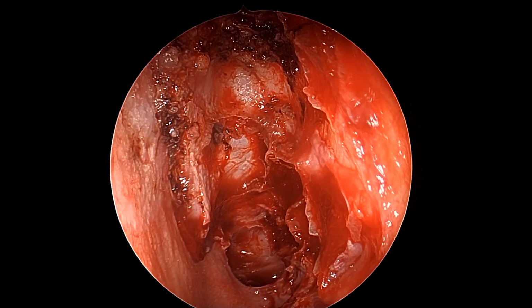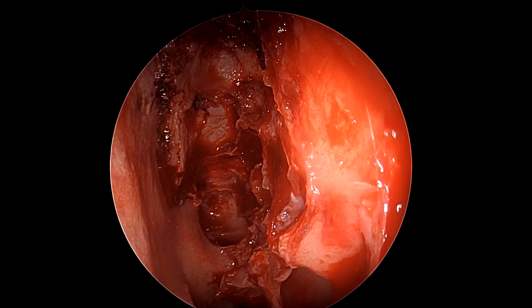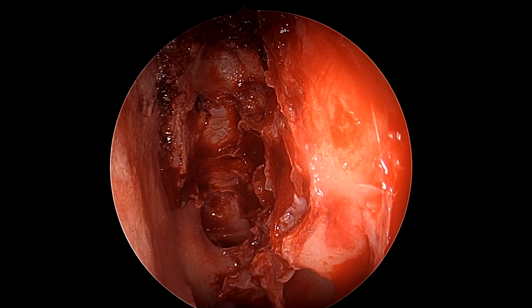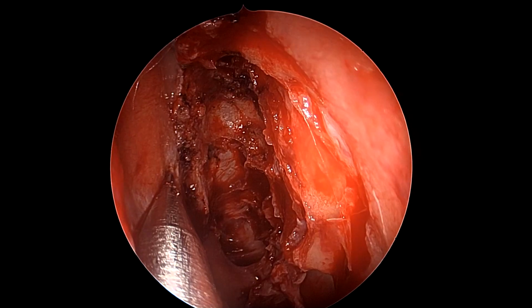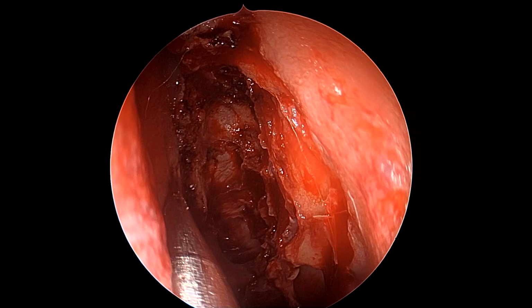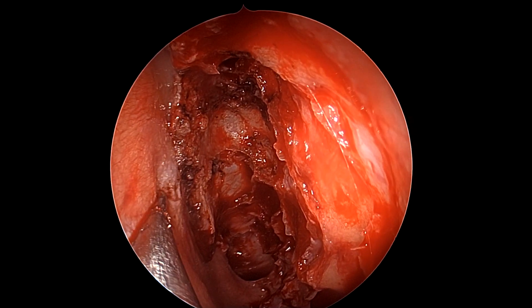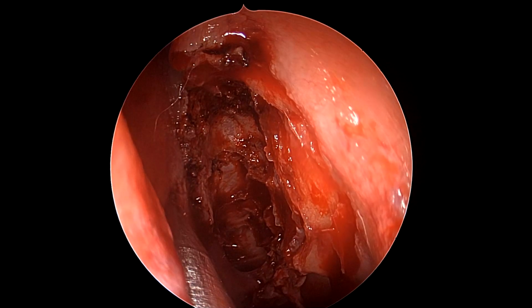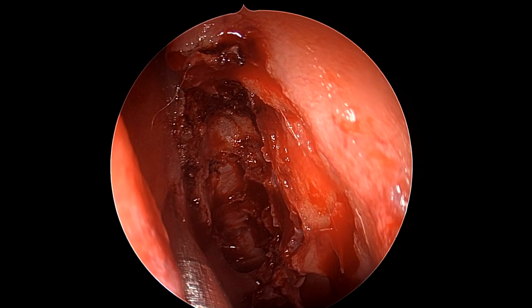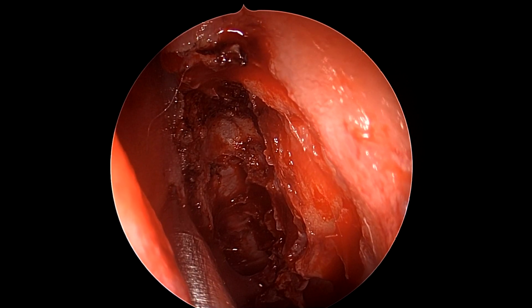So at all points, we should be very sure that we should not cause any sinus to be occluded, most importantly the sphenoid for posterior defects and the frontal sinus for the anterior defects. And now once we have isolated this defect, which we are pointing with the help of a navigator probe, you can see here it's not leaking right now because of the use of the coagulation device. Now what is left is the plugging of this using a fat plug.